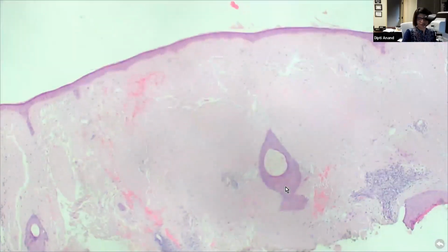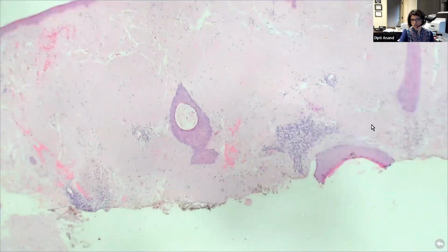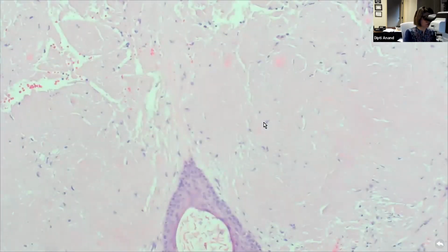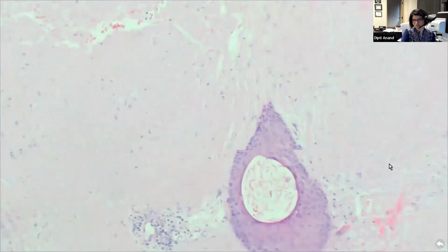Okay, nodular amyloidosis. Nodular amyloidosis presents with a complete effacement of the dermal architecture. So here the dermis obviously doesn't look normal. The collagen architecture and the elastin architecture are lost. And what you're getting is this deposition of a pink eosinophilic substance in the dermis. There is often accompanying interstitial hemorrhage. That happens because this amyloid likes to deposit around vessels, so it produces leaky vessels with all this interstitial hemorrhage.